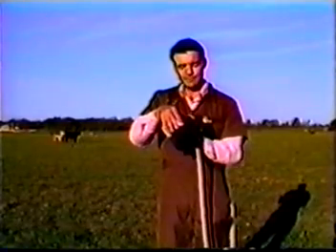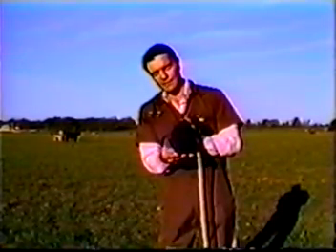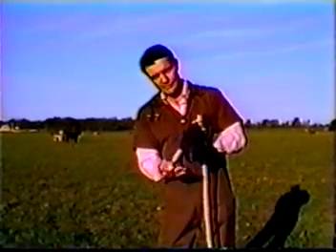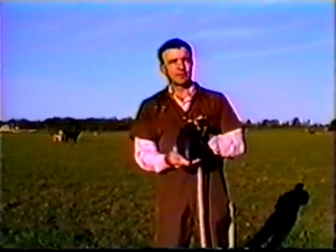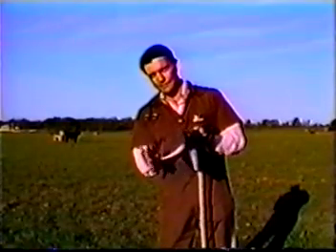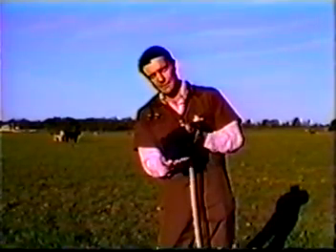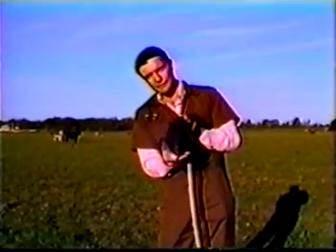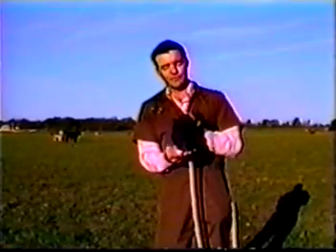So instead of coming up here and trying to emit sound waves all the way through the fluids of the pregnancy, I like to go down under, and being right-handed, I wind up having the probe or the transducer pointed to the upper left hip of the cow, to the upper left tuber coxae, almost pointed in that direction. And then I go left and right, or forward and backwards, to get the exact positioning that I wanted.